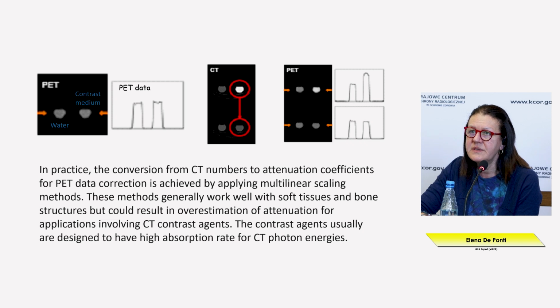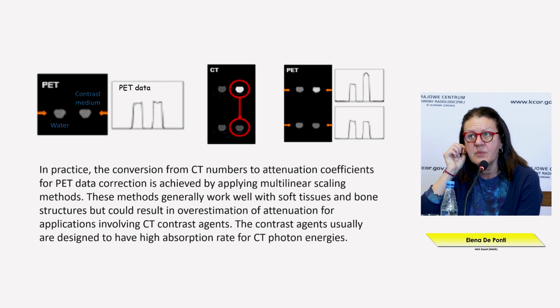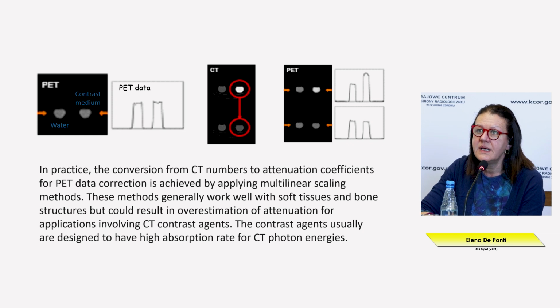Some papers have demonstrated that according to the clinical results, the impact of using a contrast medium CT is not so big, and usually expert radiologists and nuclear medicine physicians are able to identify those artifacts that are introduced by the use of the contrast medium, but we must pay attention to that as well.